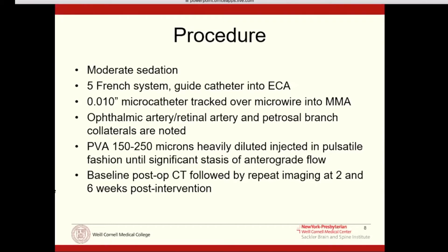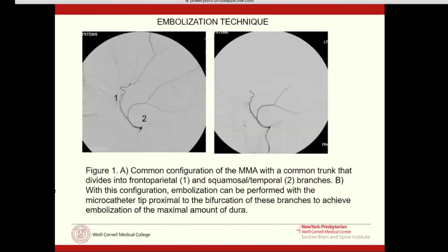We demonstrated safety and would get baseline CTs followed by repeat imaging at two and six weeks. Here's an example of the anatomy of the MMA on angiography — a lateral view. You see after the MMA makes that hairpin turn where the small petrosal branches come off, it bifurcates into basically the temporal parietal branch and the frontal branch. On the left is a pre-embolization picture; on the right is what it looks like after embolization. We don't sacrifice the entire artery — we just inject the particles distally so they take out the small arterioles that connect up with the membranes.